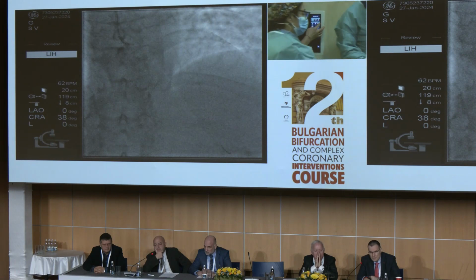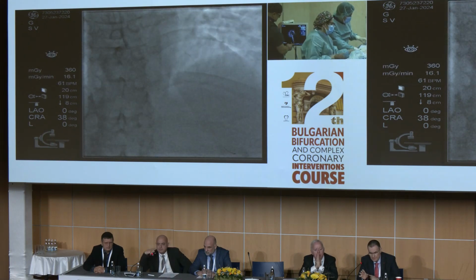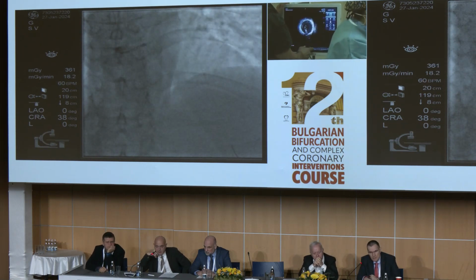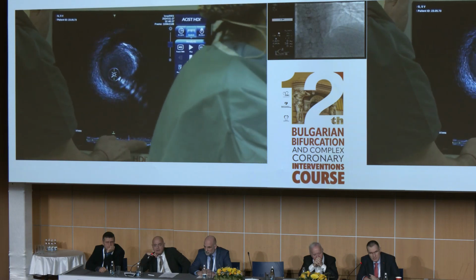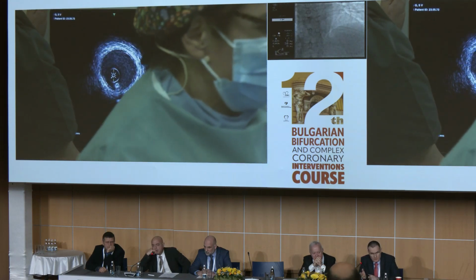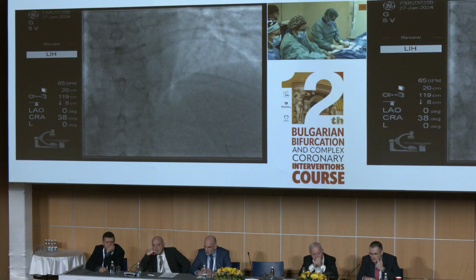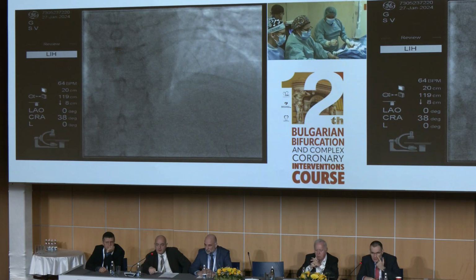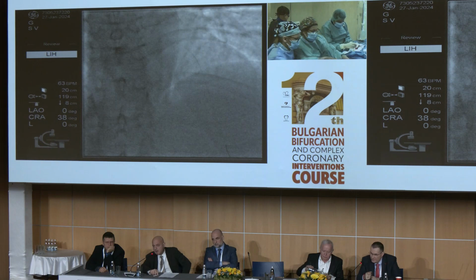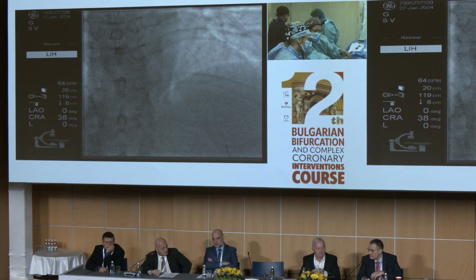is that there is a sheet, an outer coverage of the detector with the sensor, and it remains inside the guiding catheter. Now I come back and pull back the catheter inside the artery. So you can make a lot of introduction or pulling back of the IVUS catheter without traumatizing the vessel wall, just because the sheet is in place.